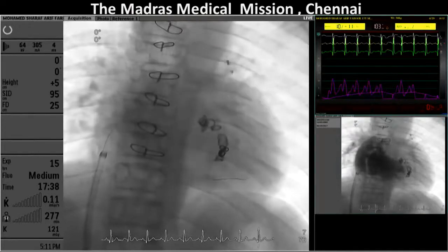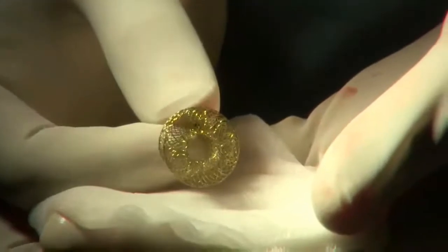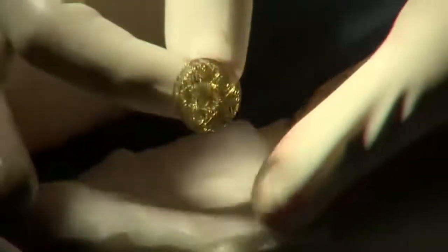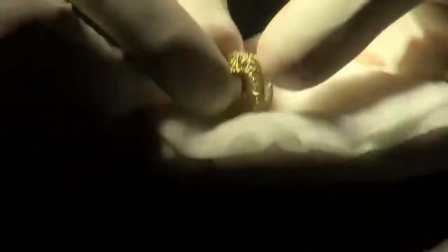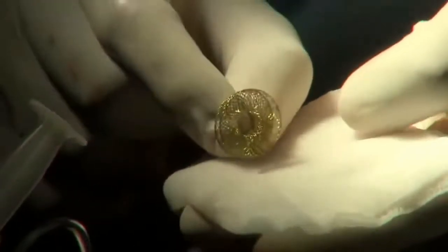Siva, yes. This is Nikas from Germany. Hi, Nikas. Hi, greetings to India. Yeah. Wonderful case. And we have just done exactly the same thing that you want to do in a patient with the same circumstances, and we used a 4 millimeter hole. And at the end, our patient improved the saturation from the 70s at rest to the 90s at rest.